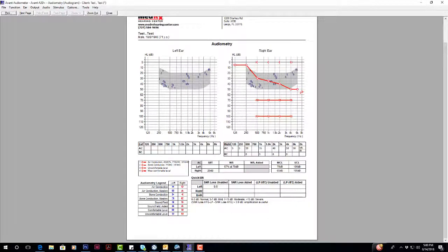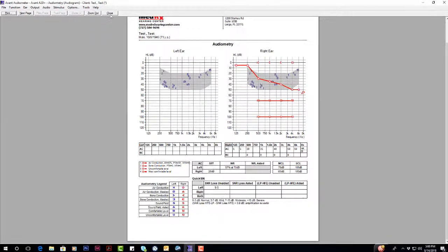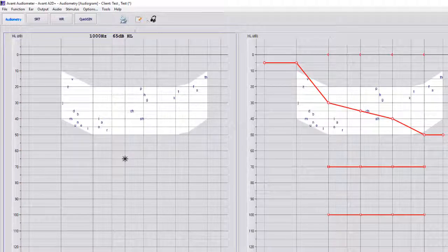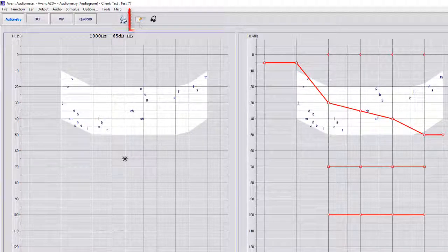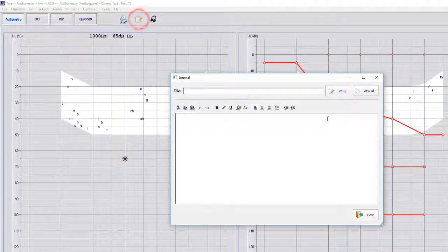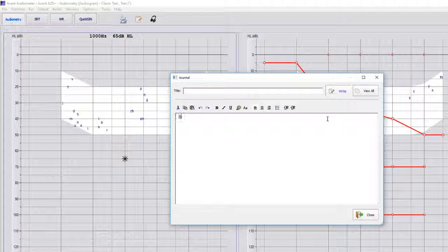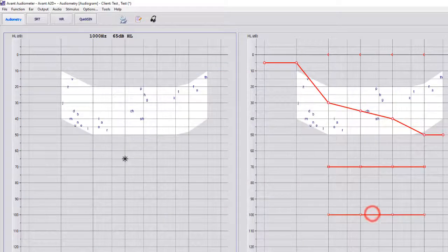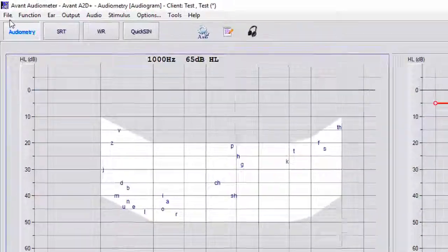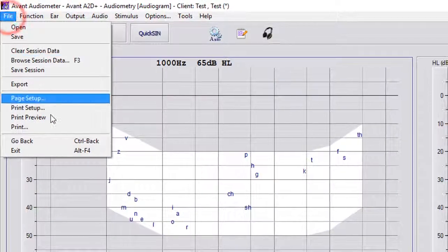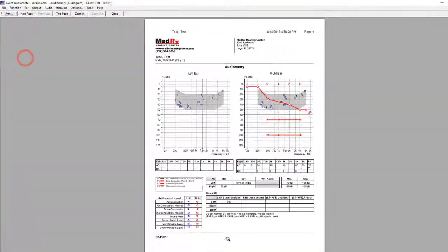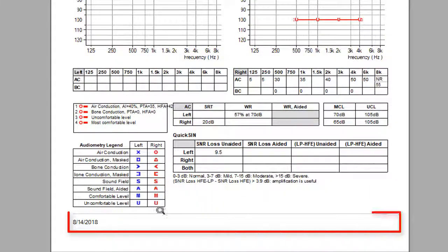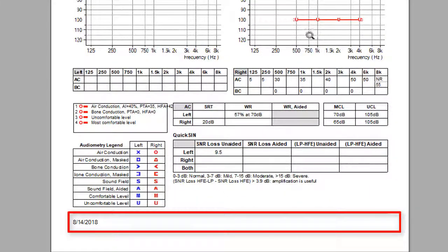And also, if we go to this little notepad right here, we can type in chart notes. And so now, if we go to file print, all of our chart notes will be at the bottom and they'll carry over to another page so you don't have to write chart notes anymore.